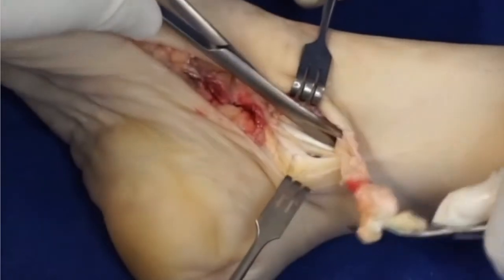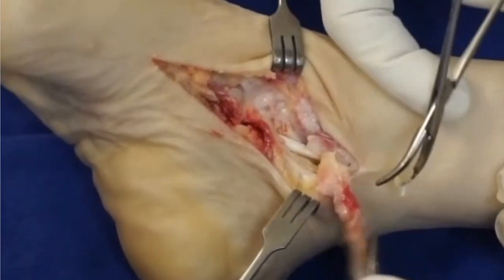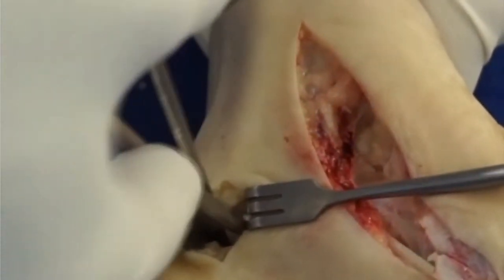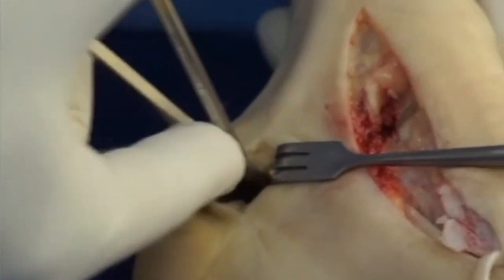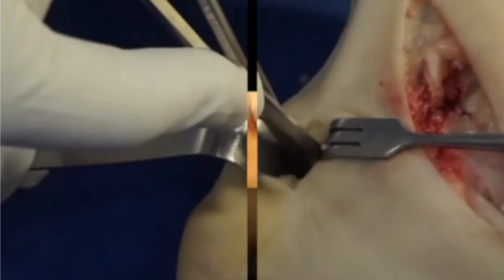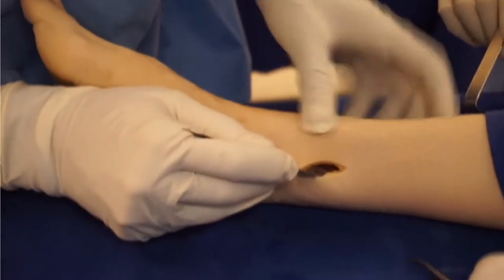Once I'm done with my tendon release, I can then start to focus on the other soft tissue release, which is the plantar fascia release. I'm going to make a small incision on the plantar medial aspect of the foot rather than under the plantar surface. I open up the foot, dissect it, and then use scissors to split all the way across — it's a complete fasciotomy. Then palpate under the skin to make sure that you've cut both bundles of the fascia.